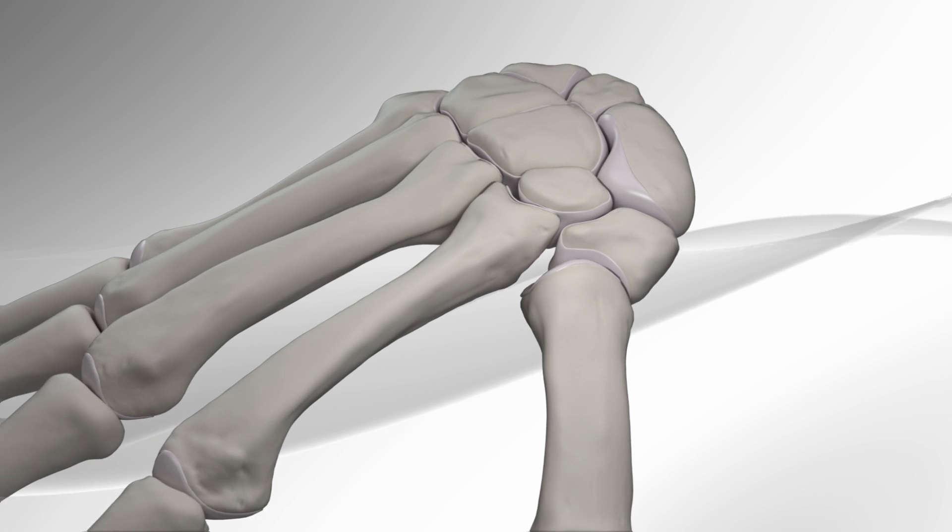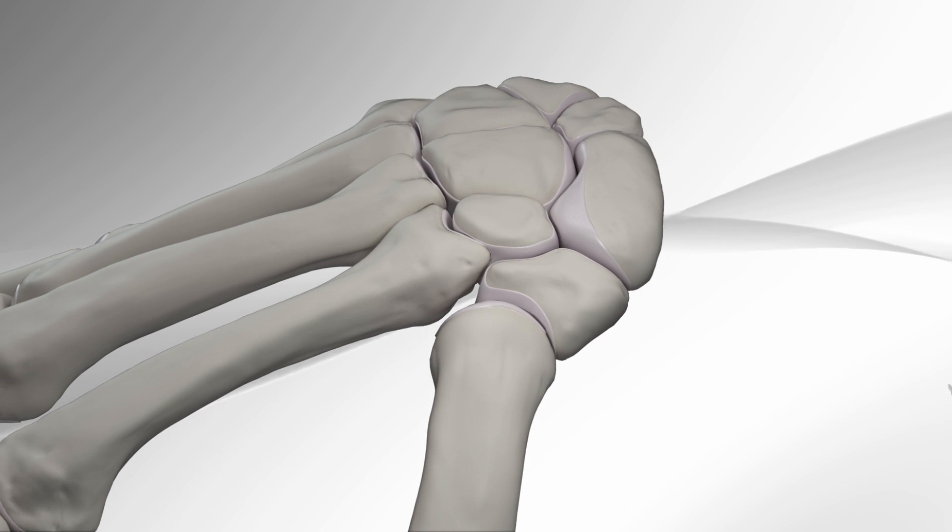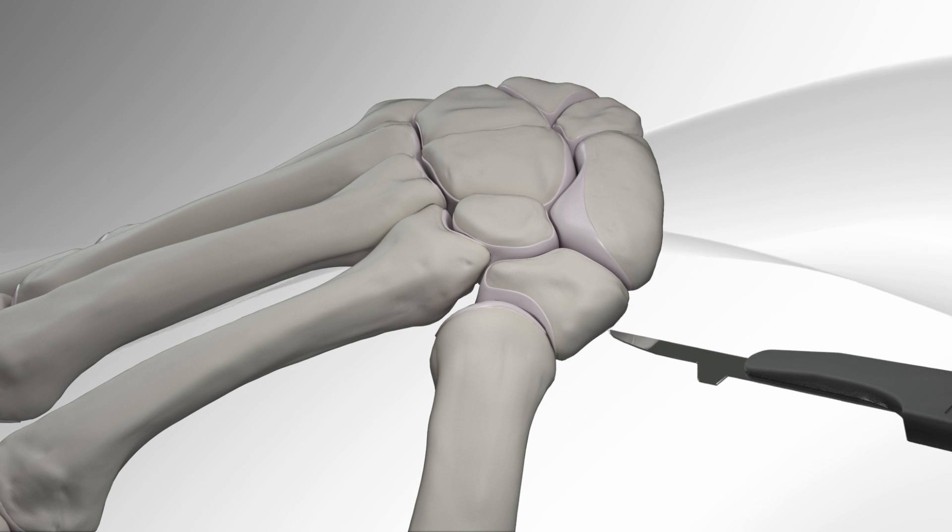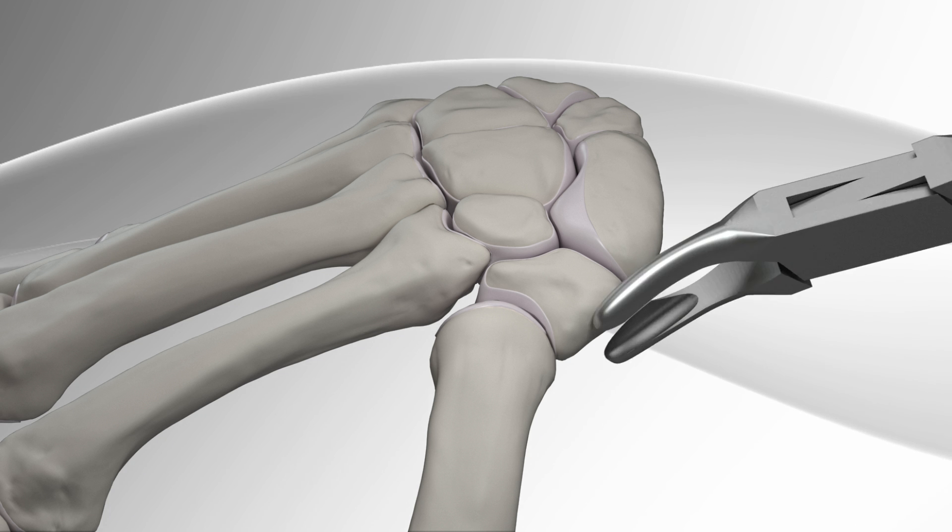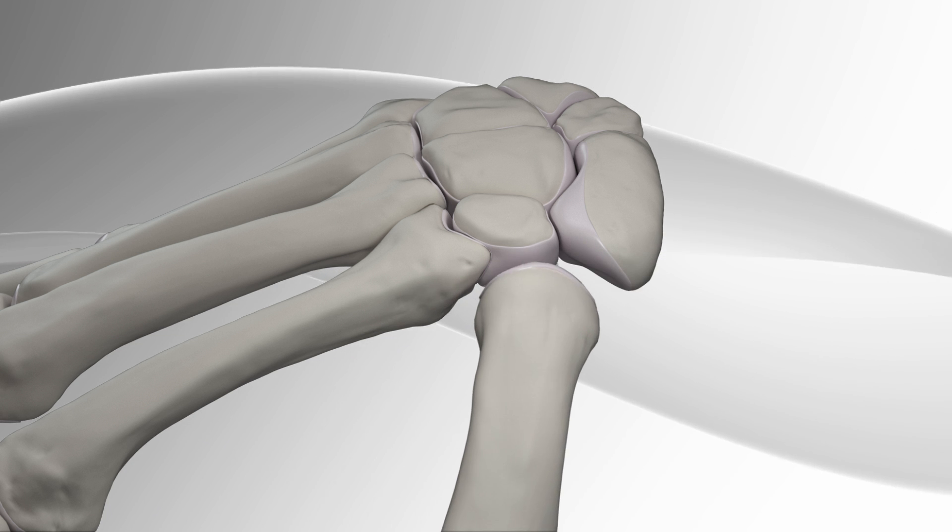First, a skin incision is placed at the base of the thumb to expose and remove the diseased bone, trapezium. A second skin incision is placed between the index and long fingers at the upper portion of the hand.